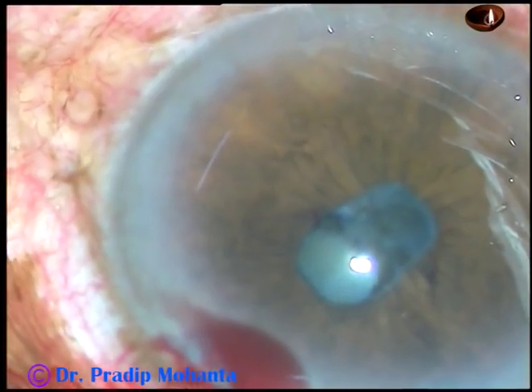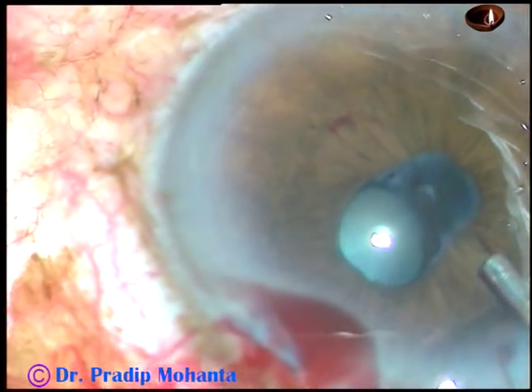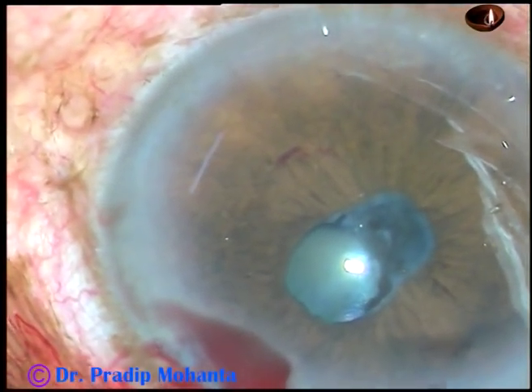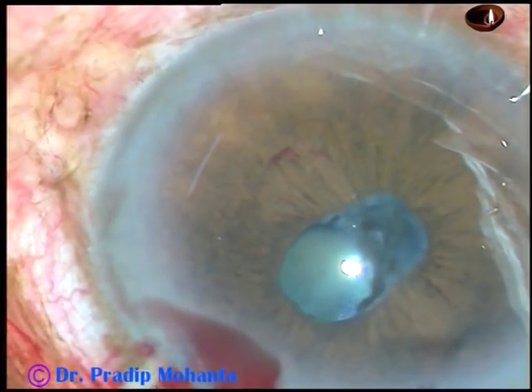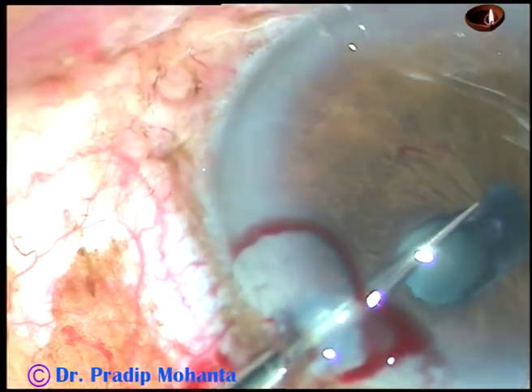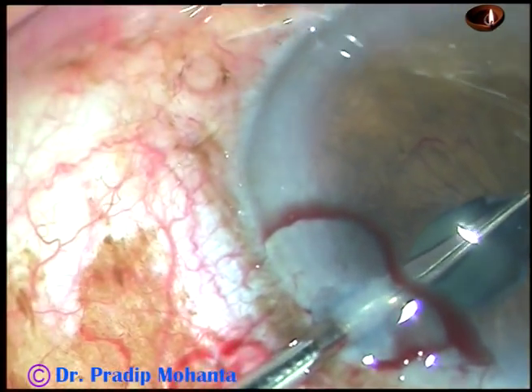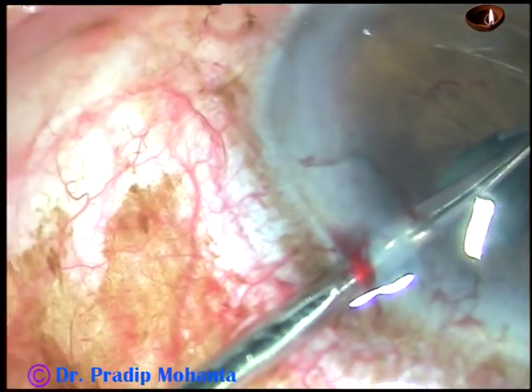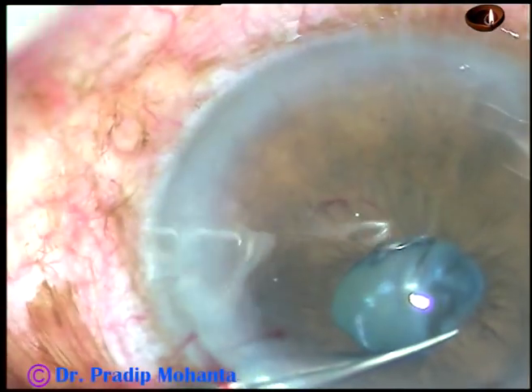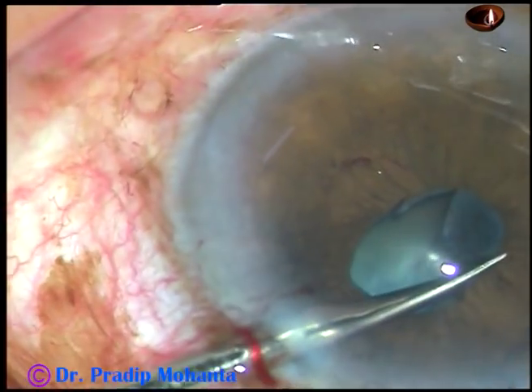So we should not pull it. We have to cut this membrane along the pupillary margin. So I inject some visco behind the iris and some in front of the iris. Take the micro-scissors again, go through the side port at 1:30 o'clock, and cut the fibrous membrane close to the pupillary margin. The membrane is being cut on the inferior aspect. Now I come to the superior aspect and cut the membrane superiorly.